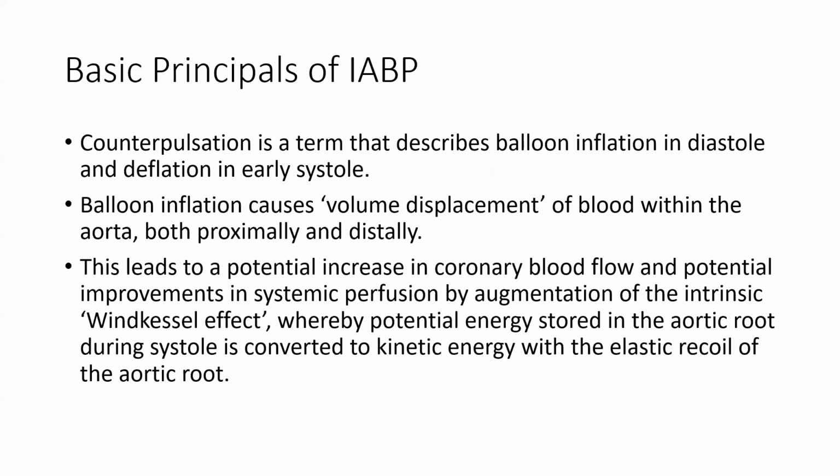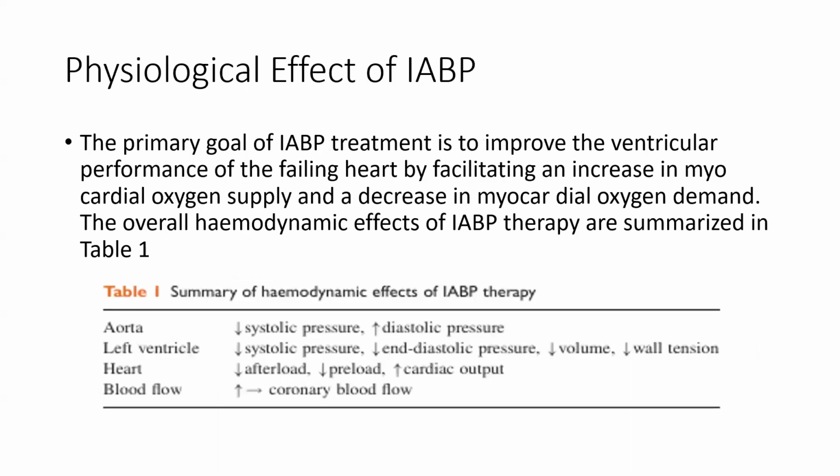Counterpulsation is the term that describes balloon inflation in diastole and deflation in early systole. Balloon inflation causes volume displacement of the blood within the aorta, both proximally and distally. This leads to a potential increase in coronary blood flow and potential improvement in systemic perfusion by augmentation of the intrinsic Windkessel effect, whereby the potential energy stored in the aortic root during systole is converted into kinetic energy with elastic recoil of the aortic root.